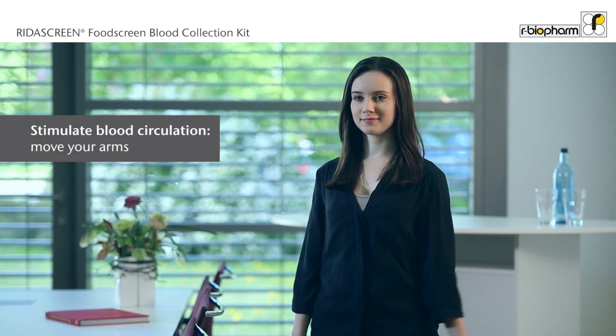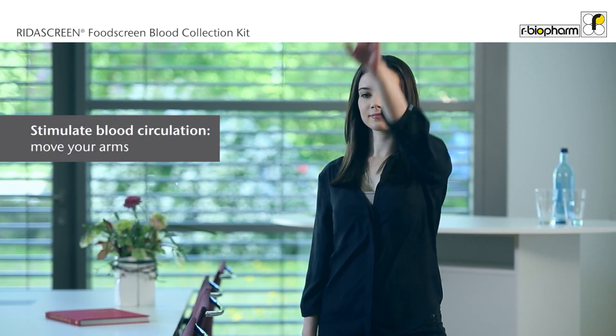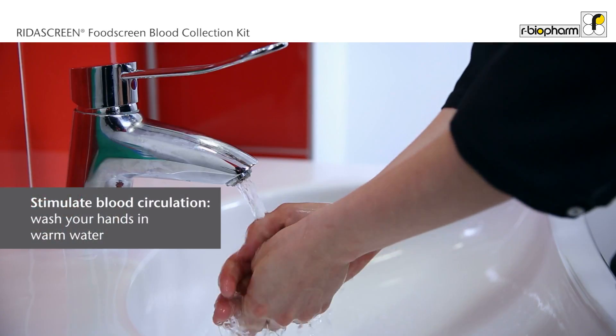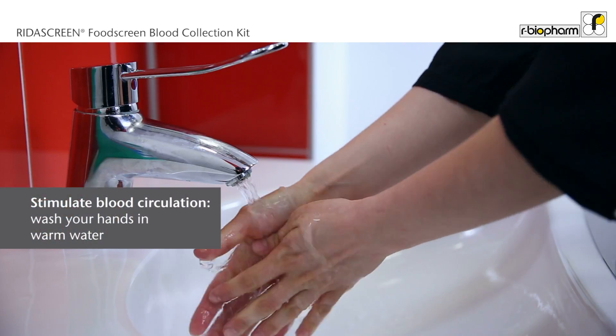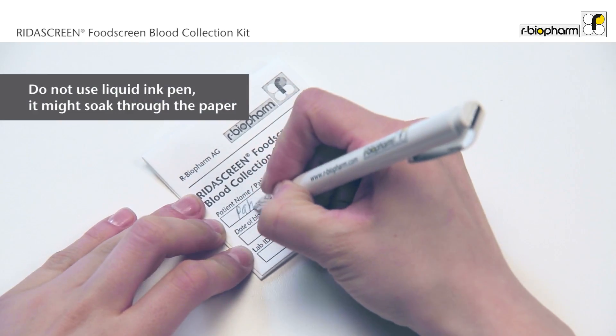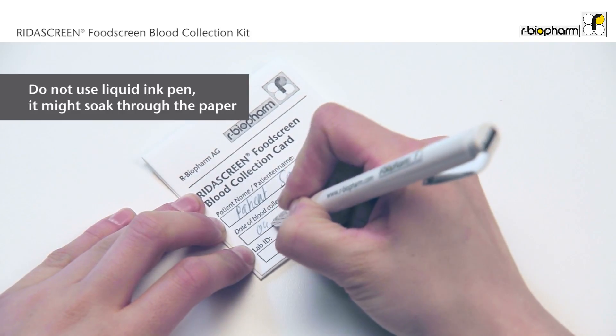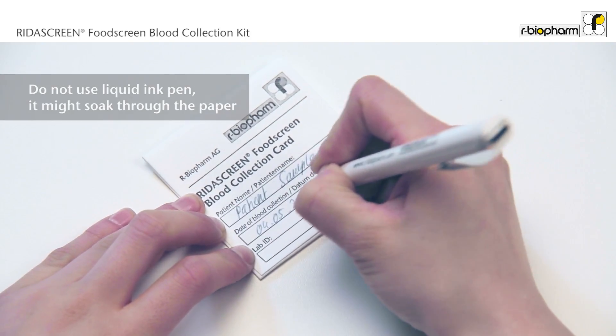Move your arms to stimulate blood circulation. To further stimulate your blood flow, wash your hands in warm water. Use a pen to write your first and last name as well as the date of blood collection on the card. Fill out the forms provided by the laboratory if applicable.